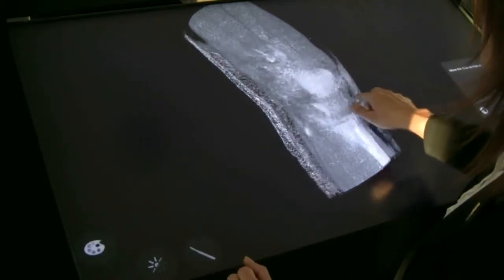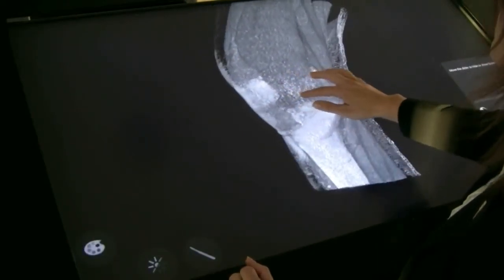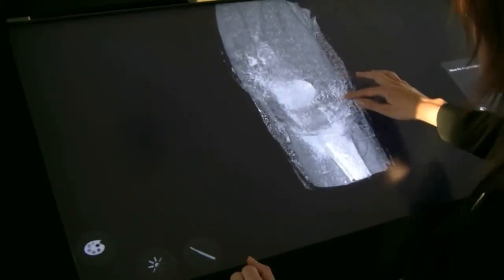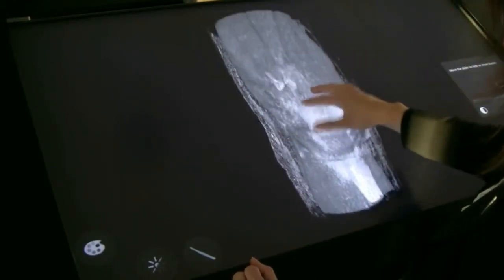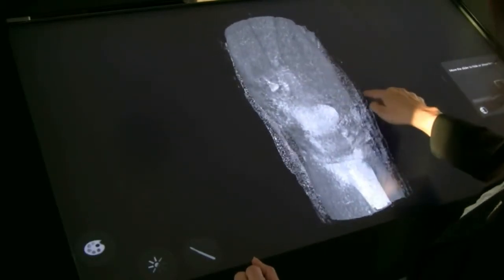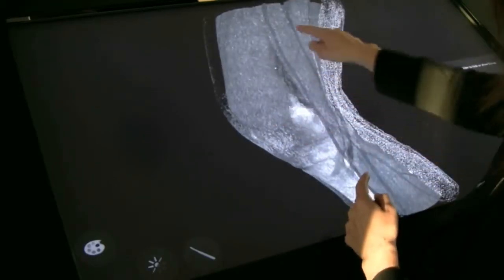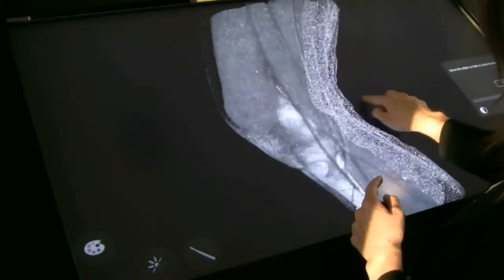And if I apply the soft tissue preset, I will get a good view over the soft tissue such as muscles and ligament. And as you see here, now we have the quadriceps. I have also some visible vessels.